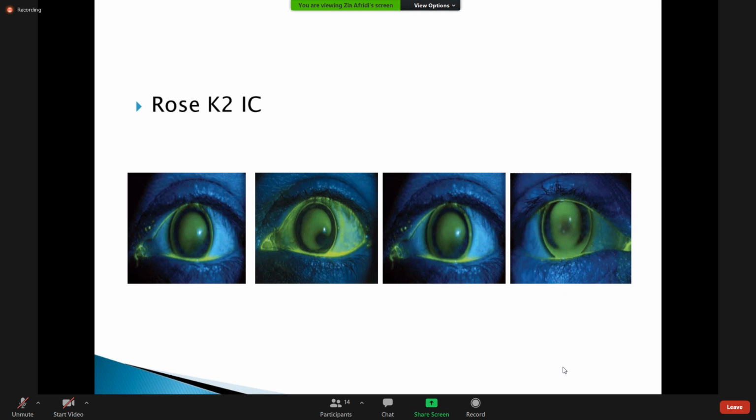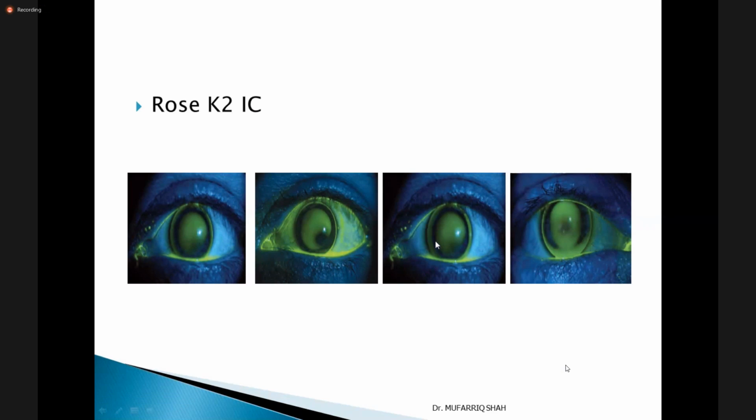So in the second case here, the edge lift is insufficient. So you need to increase the edge lift, right? So what about the third one? More peripheral edge lift. Yes. Here, too much edge lift is greater, so you need to decrease the edge lift.